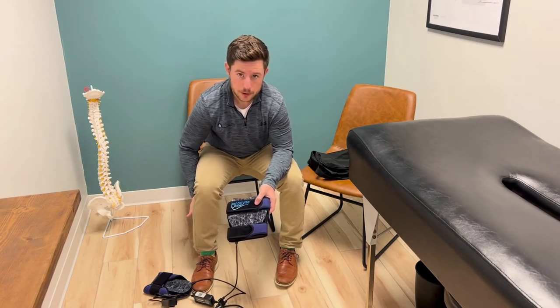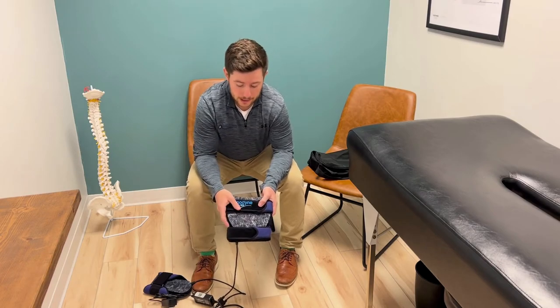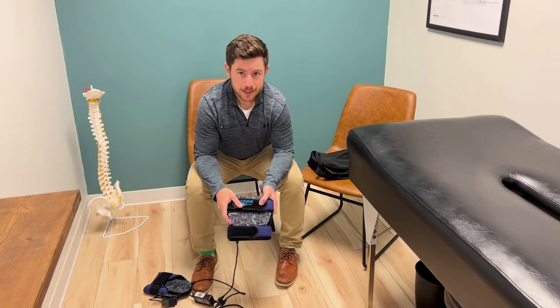Treatment is 30 minutes per extremity, or per leg. Thank you so much for listening, and as always, live the advantage.